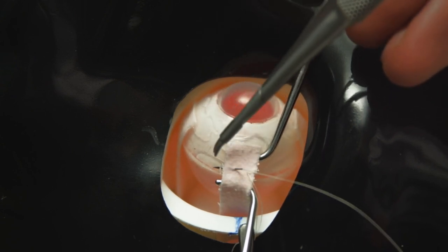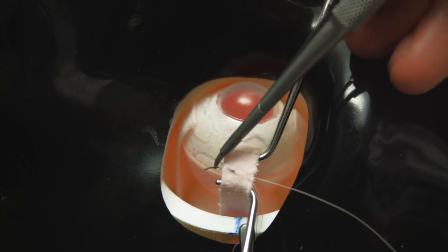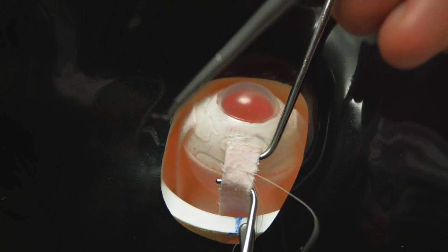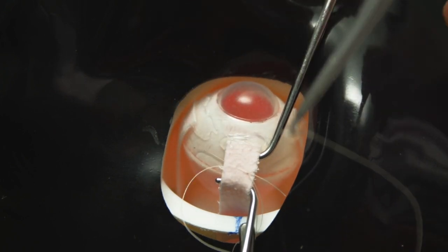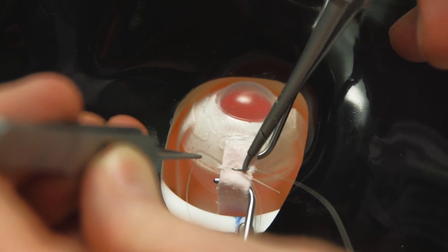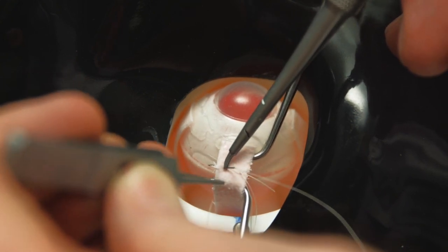Of course we can't mimic the effect of the muscles bleeding and there's no need to cauterize these muscles, but discussion about the role of cautery in both recession and resection techniques is obviously important preparation for live surgery.